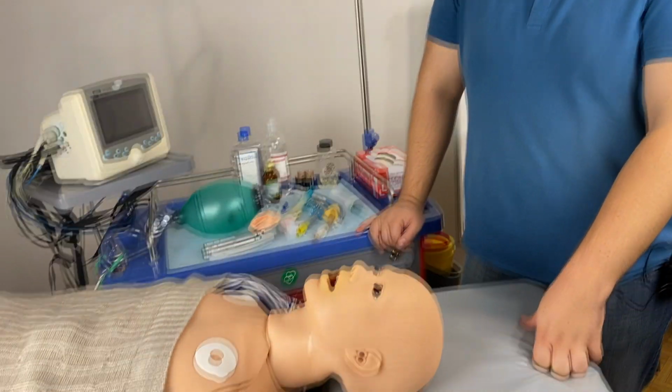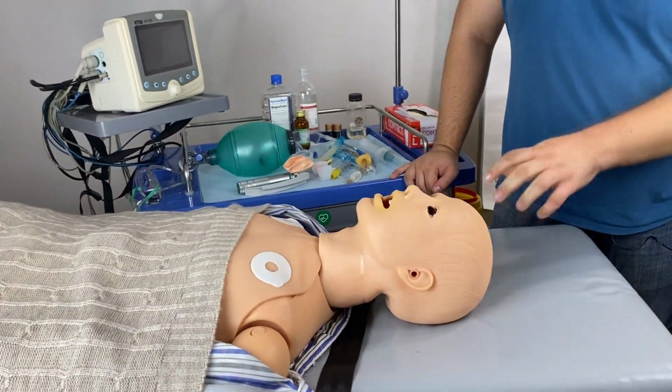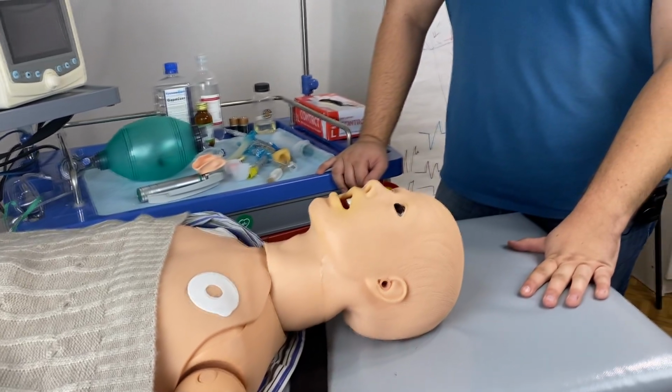And also, we don't do the intubation every time because it's a long manipulation. Right now on the mannequin it took only several seconds, but patients may look different and the situation may be much worse. And in this case, the intubation will not be possible, for example, from the first attempt, or will not be possible at all. That's why if we are, for example, in cardiac arrest and we are short on staff and we cannot waste time on doing all that stuff, we can skip the intubation, but we can replace it with another tube, just to save us some time.